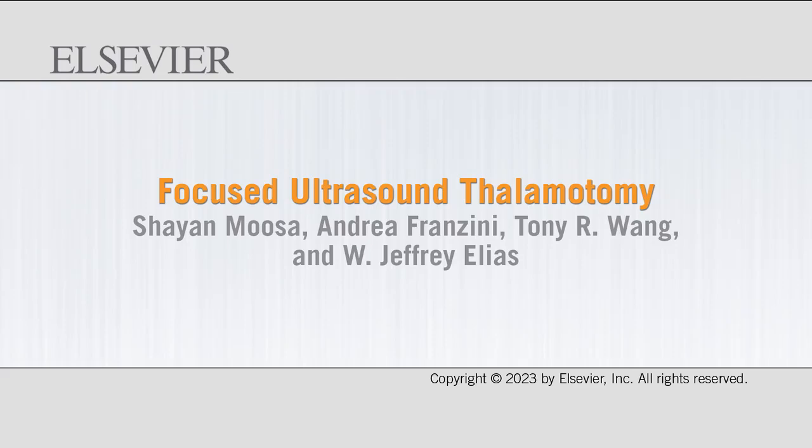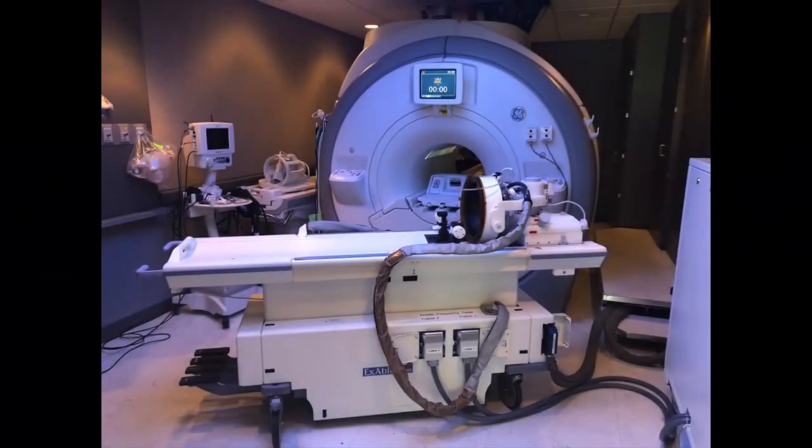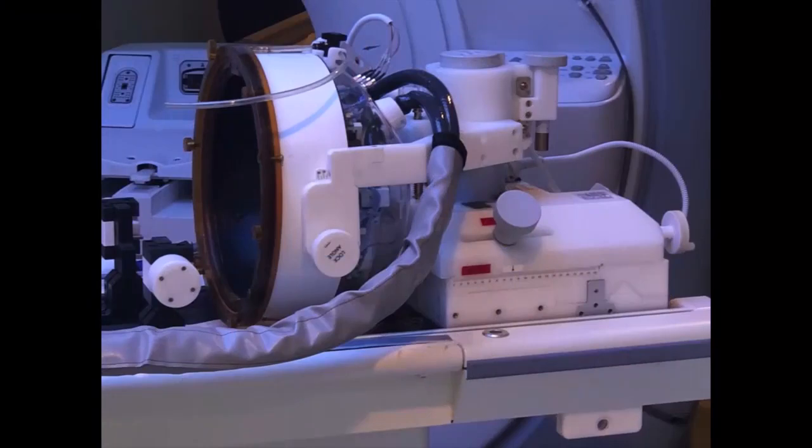In this video, I'll briefly walk you through a magnetic resonance guided focused ultrasound thalamotomy. This procedure is incisionless, minimally invasive, and FDA approved for the unilateral treatment of severe, medication-refractory essential tremor and tremor-dominant Parkinson's disease. The focused ultrasound transducer, which is attached to an MRI table, has a hemispheric phased array configuration of 1024 individual acoustic elements. The transducer can be translated in 3 planes and tilted to optimize its acoustic focus.